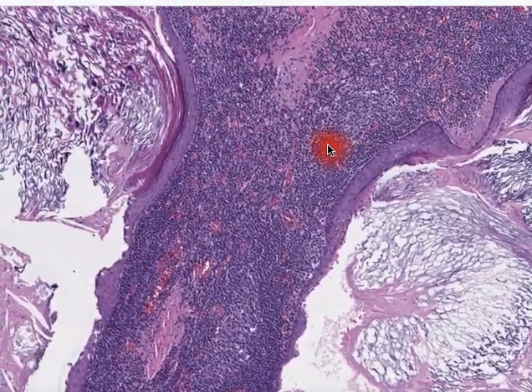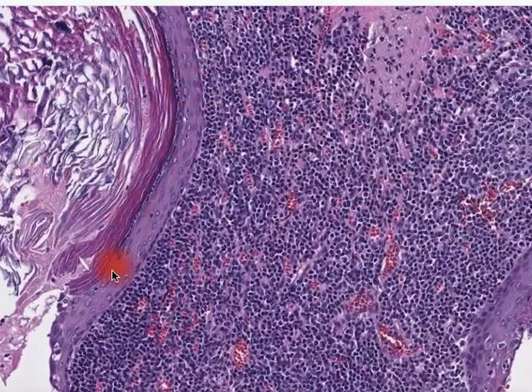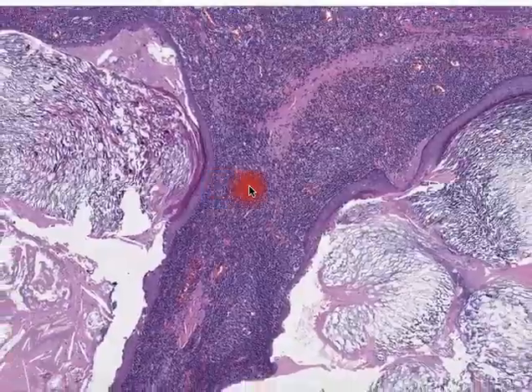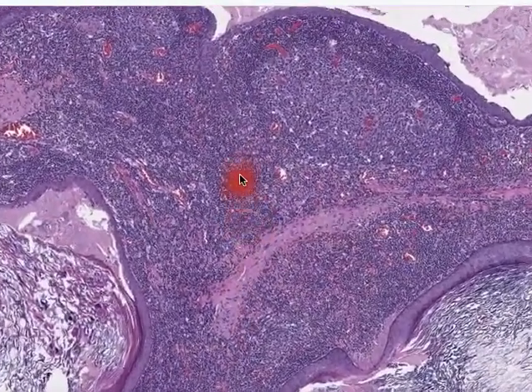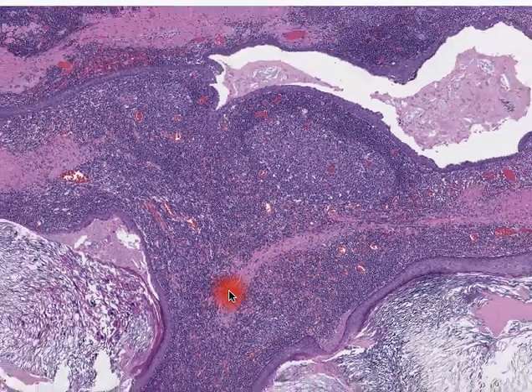Here a little bit further, we see the granular layer quite nicely developed at the juncture of the cyst contents and the epithelium. Now this stroma surrounding it is obviously lymphoid tissue, with even areas of germinal center formation and variable amounts of fibrous tissue.